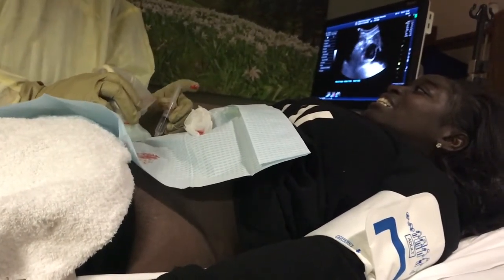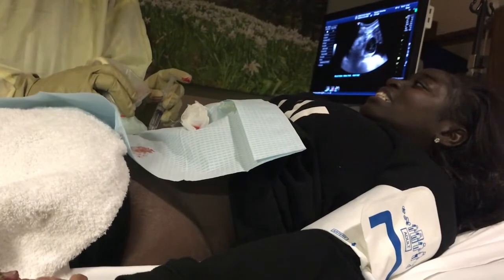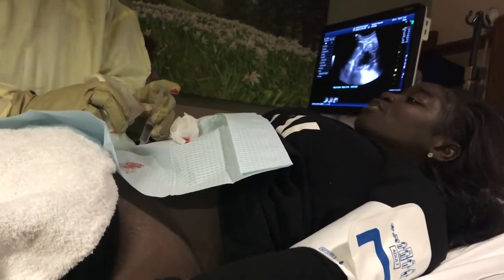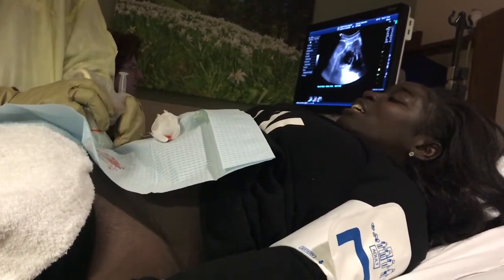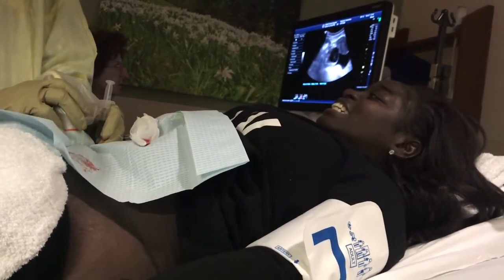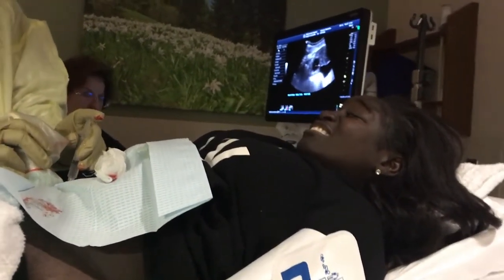He's giving me more lidocaine — injecting it in. I'm not feeling all of it because I already have some in, but I communicate with him to tell him whether I can feel it or not, and he's asking me questions throughout.